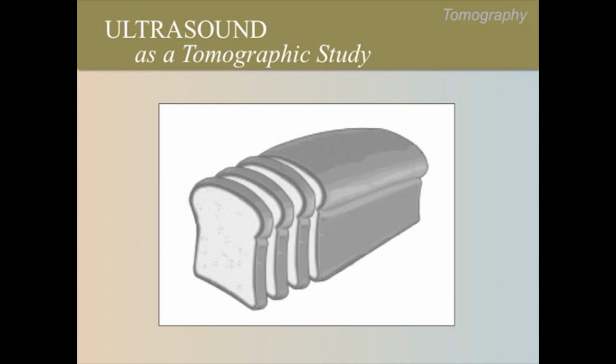Each image is like a slice of bread. When all the images are combined, the object becomes three-dimensional. As you become more proficient at ultrasound, you will begin to visualize objects as three-dimensional in your head as you scan.